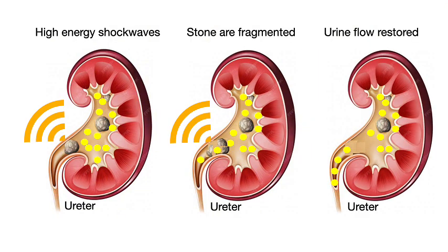Where do the shockwaves fit in? This figure shows a shockwave lithotripsy treatment. The left and middle panel show shockwaves directed at the lower stone. The right panel shows that the urine flow is restored after the lower stone has been fragmented. Understand now? Great explanation. Now, tell me about the objectives of the study.